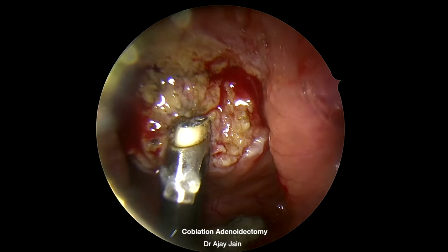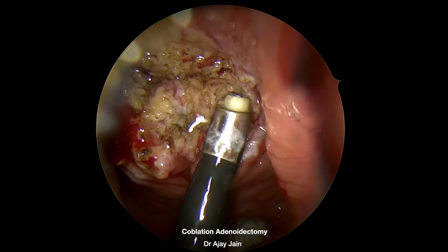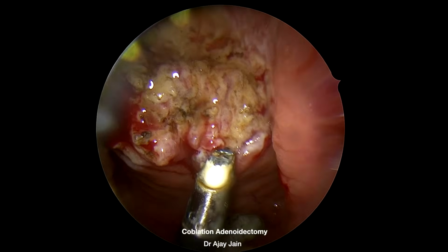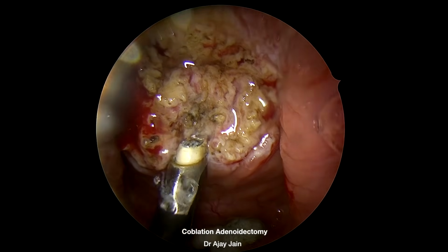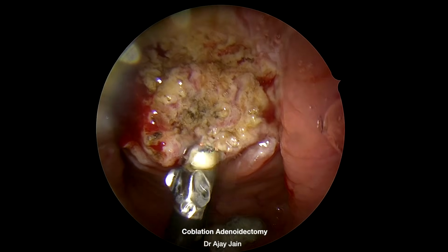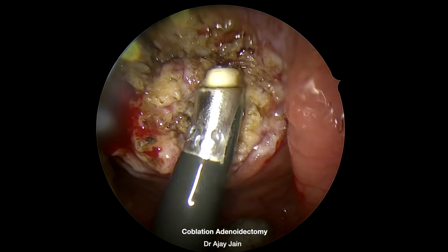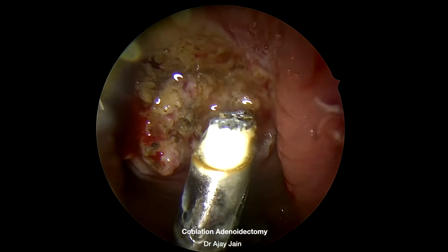Again, some bleeder has opened up in the center, which I have cauterized. So you can see more depth on the left hand side compared to the right. Once you finish this on one side, you automatically know how much you have to reduce on the opposite side. But the less you insert the nasal endoscope repeatedly, the less are the chances of synechia forming. Sometimes the nasal mucosa is so traumatized that the lens always becomes bloody, especially in very young children, then it is difficult to do.